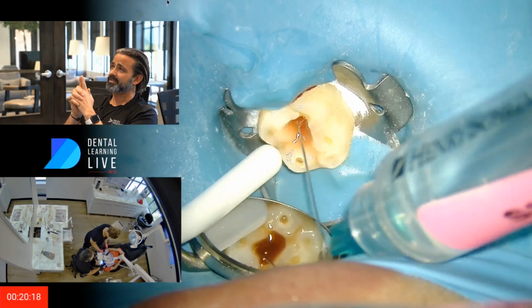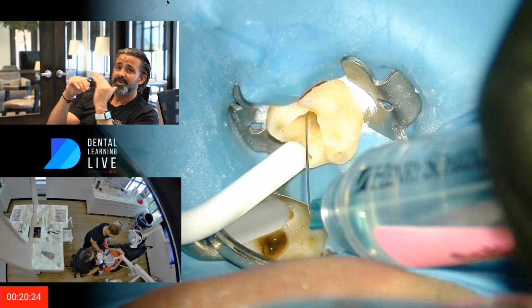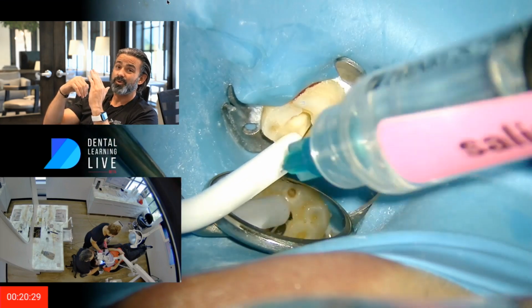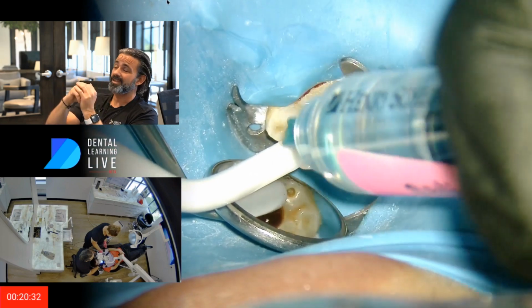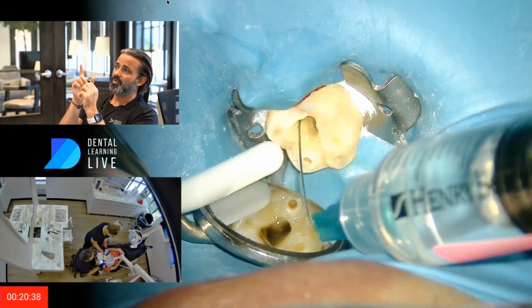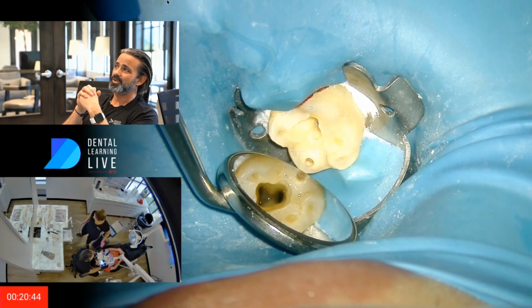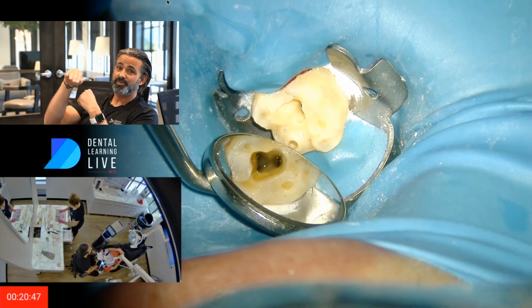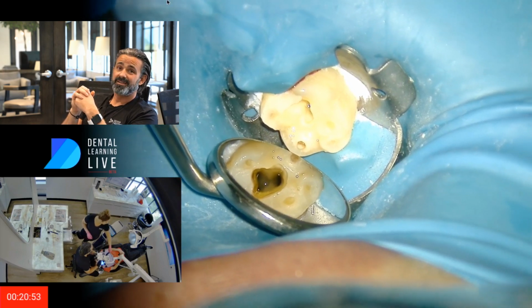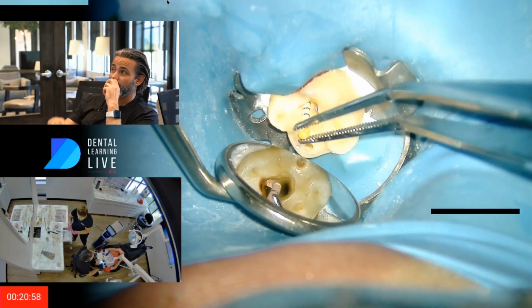Now, a couple talking points. I paid attention to that mesial wall. That composite stayed intact because when they built that composite up, they actually didn't remove all the decay. It was an indirect pulp cap. In hindsight, 2020, right? Figured it out. It was an indirect pulp cap. And the reason I know that is, as you watch me flushing this out of the system, I start paying attention to that mesial wall, and sure enough, the GentleWave actually removed that tertiary dentin and that affected dentin with caries. So what was left behind from the filling was actually removed with the GentleWave.